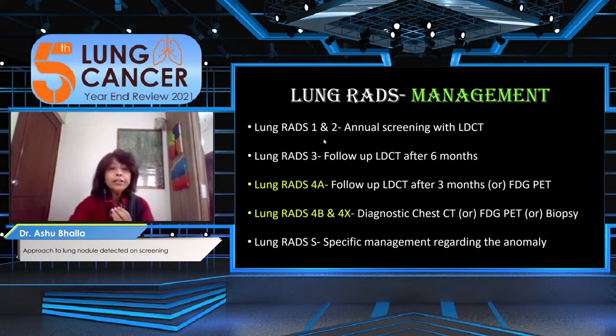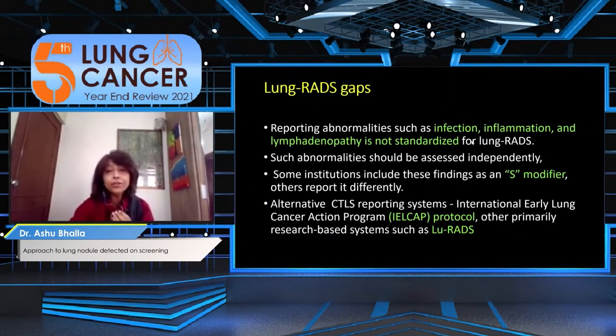The recommendations to summarize: 1 and 2 are negative screens. They continue with LDCT. 3, follow up at 6 months. 4A, follow up at 3 months or FDG PET. 4B and 4X, you definitely do a full staging exam and biopsy. So there are gaps, that you can detect so many other things.